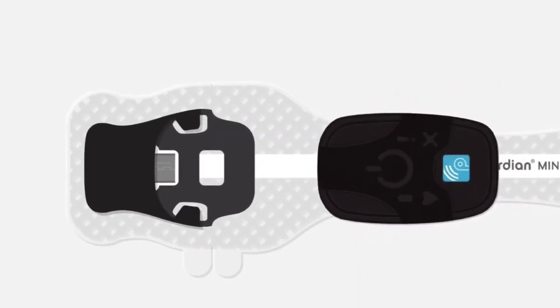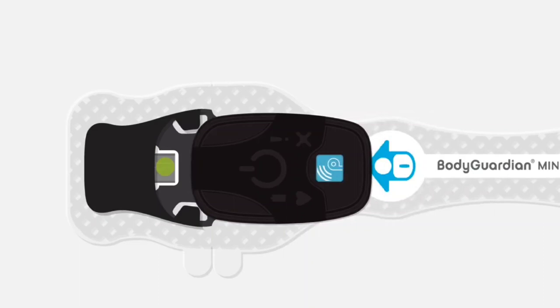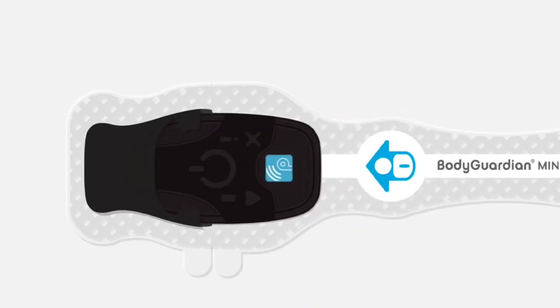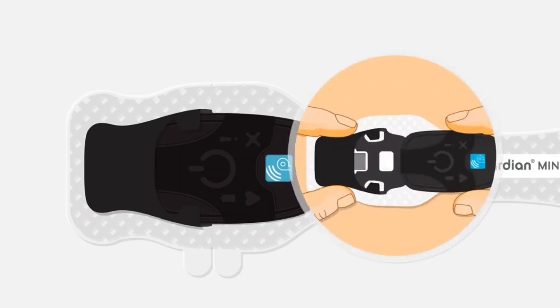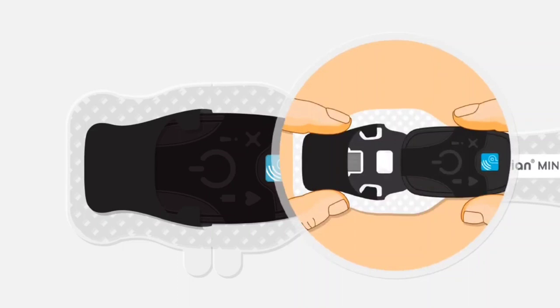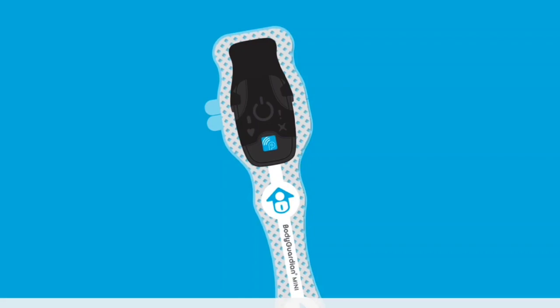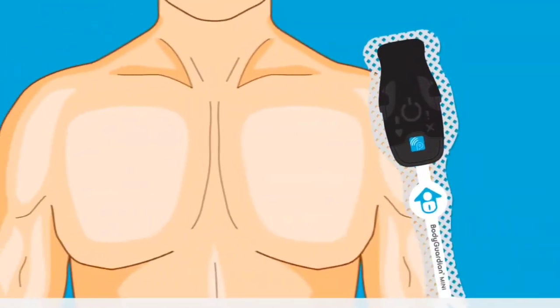Now let's take you through the steps to attach the monitor to the strip. Slide the monitor into the black molding until the micro-USB connector on the strip is inserted completely into the monitor. This is most easily accomplished on a flat surface like a table. To line up the micro-USB connector with the port on the monitor, you may need to wiggle the monitor slightly to align. To ensure a good connection, pinch together with thumb and index finger. Hold the monitor and strip assembly by the monitor, then peel away the strip's adhesive backing. The backing is removed in two separate pieces by peeling back the tabs.